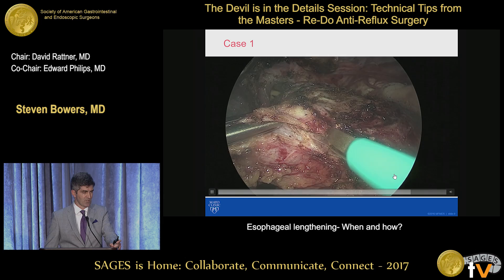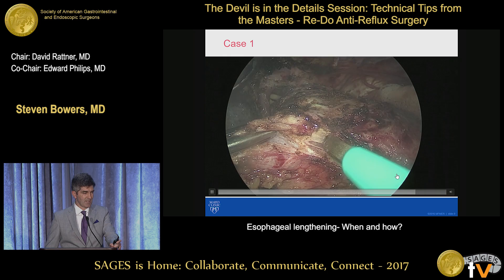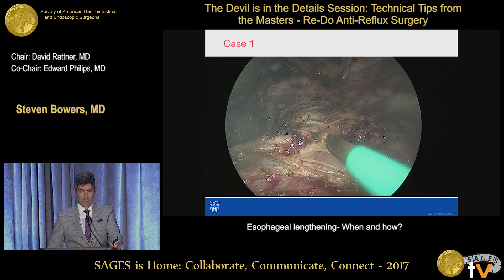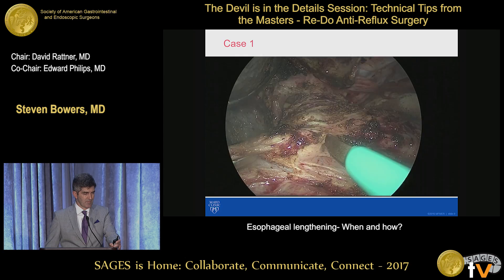So here's taking the kiss of the fundoplication. Some people staple this. I like to use scissors and just, if I can find where the sutures are, I know I'm in the right spot, and just very gently tease this part, and then take the entire wrap down. You can see I'm coming up on an Ethibond, so I know I'm in the right plane, right between the two kisses of the fundoplication.